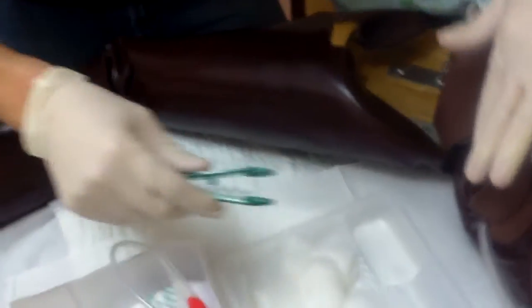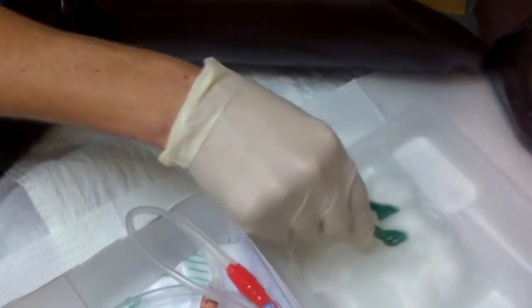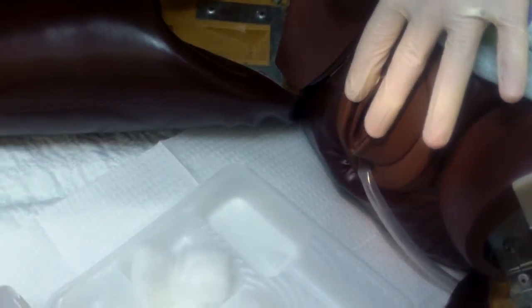So then this is gonna be my clean hand, and this is my sterile hand. I'm then going to use this to clean the labia. Thank you, assistant with a pen light. So I got my thing. I'm gonna start out at the labia, go 1, and then done.